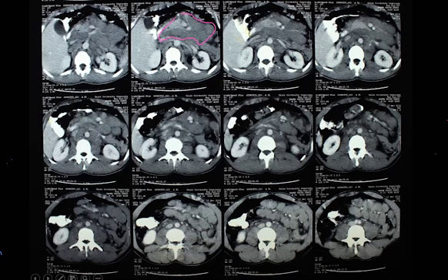Maybe lymphoma. We don't know if it is systemic or localized. Para-aortic, of course, they could be something localized. You name them, the stomach, the pancreas, the colon. Of course the colon, colorectal cancer, is the commonest, but it can be pancreatic, can be esophageal, can be gastric, can be whatever it is. But it could also be a lymphoma.